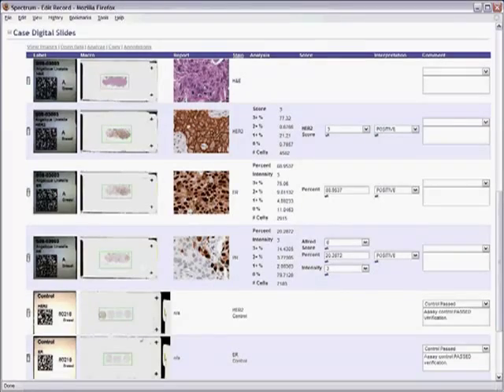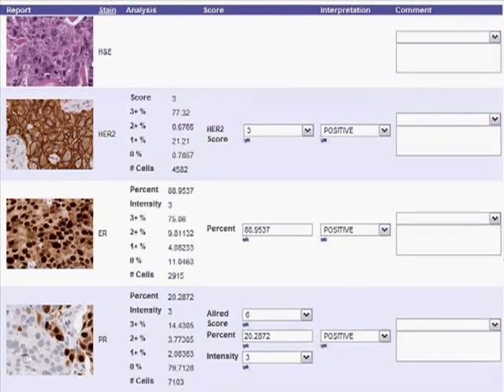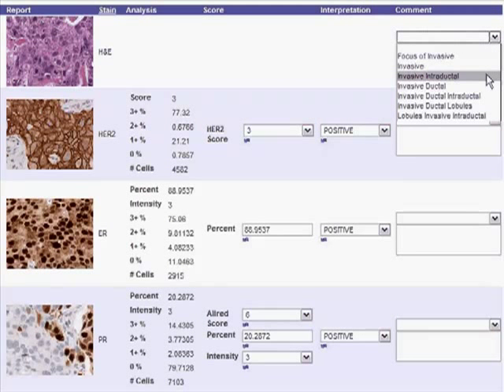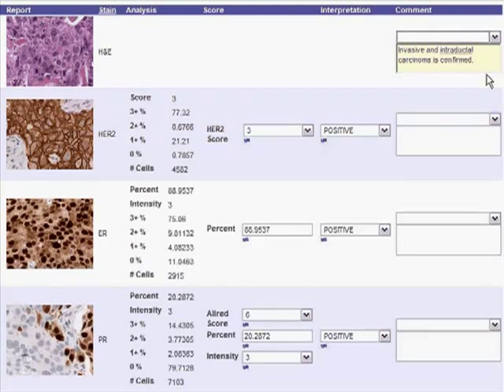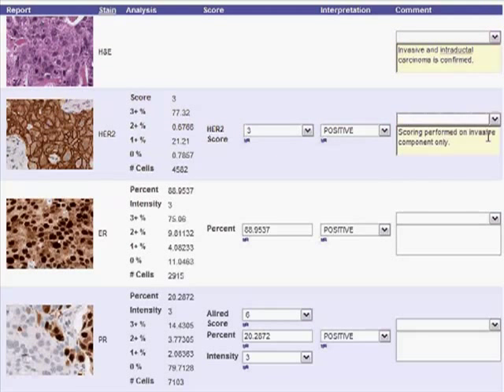Aperio automated the data flow from analysis to reports for you, providing automated score and interpretation calculators that can support any scoring scheme you choose, such as the Allred score or the H score.